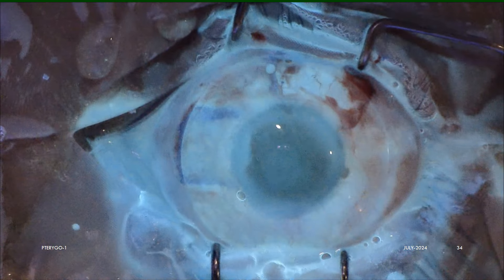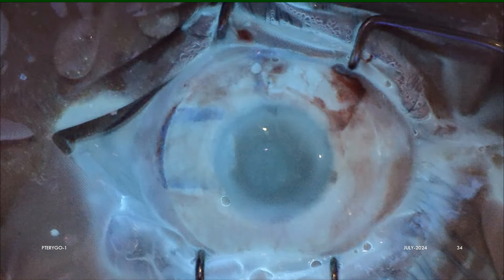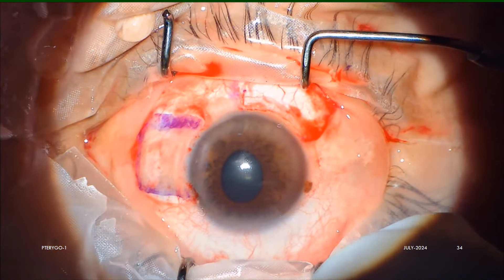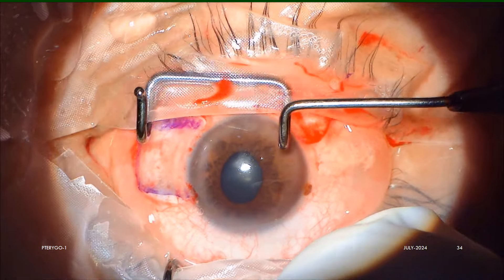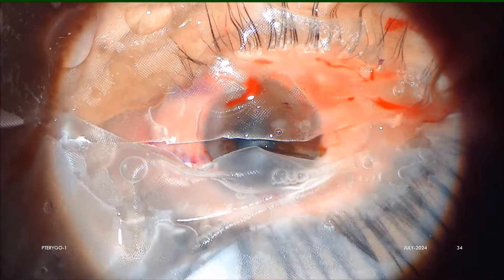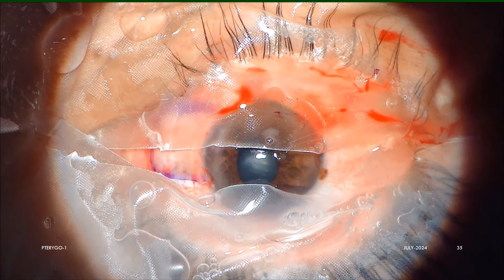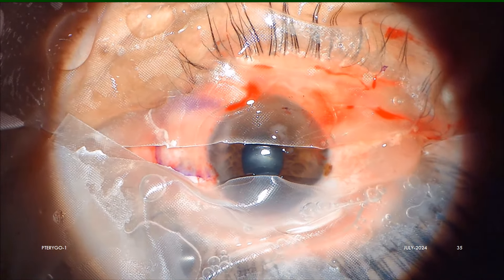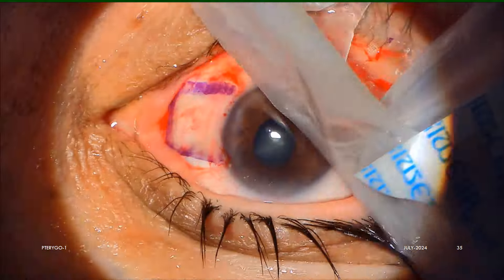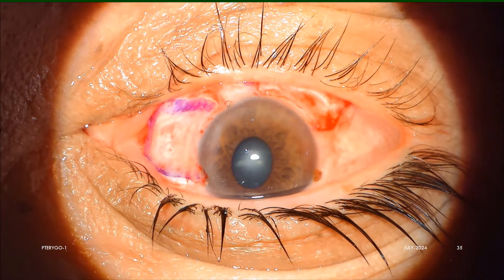The speculum is then gently removed, always under the direct microscopic vision of the surgeon, so that we make sure that during speculum removal neither the lens nor the graft has moved from its in-situ position. We prefer also to remove the drapes under the microscopic vision of the surgeon, just making sure that the graft and BCL both are undisturbed and in situ.